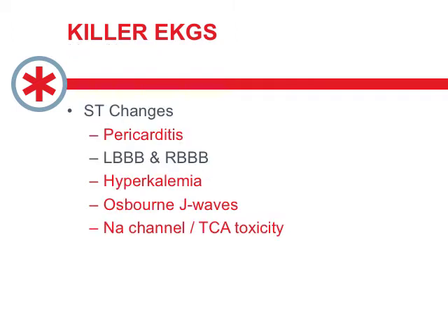There are a few other further ones that we are probably responsible for, and a lot of these occur in the ST segment of the ECG. So I think we have to be able to identify pericarditis and understand when it's that, particularly because it's going to give us ST elevations and we're going to be thinking about acute ischemia.